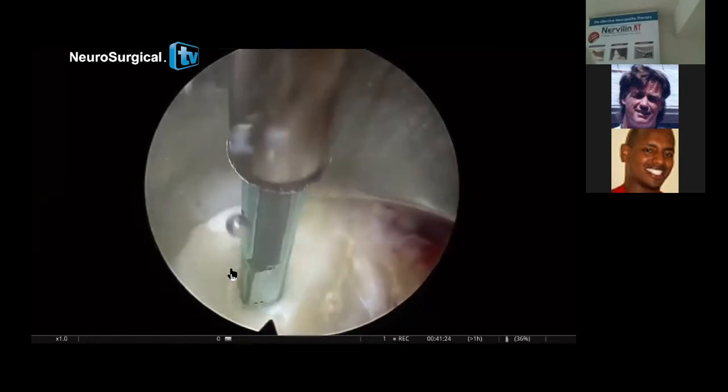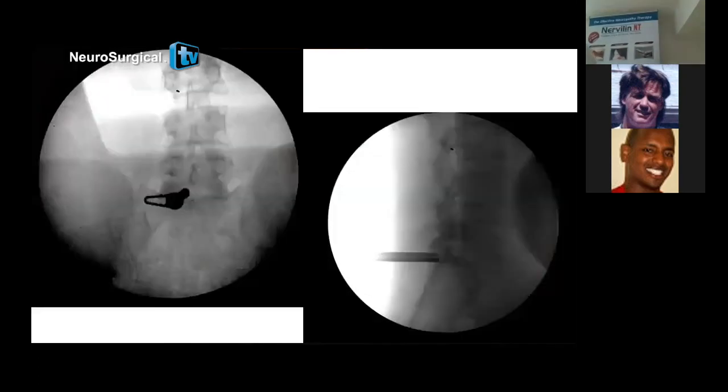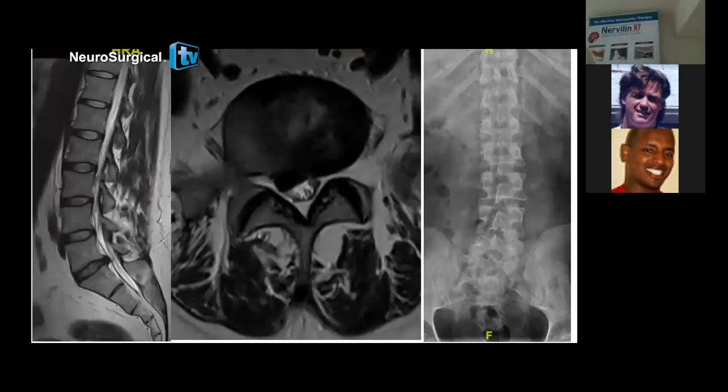Now I'm going to show another interesting case, L5S1. Can you see the window? Yeah. And the iliac bone here. And it is interlaminar. Transforaminal is not good for this case here. Very big interlaminar area. The placement of the things.